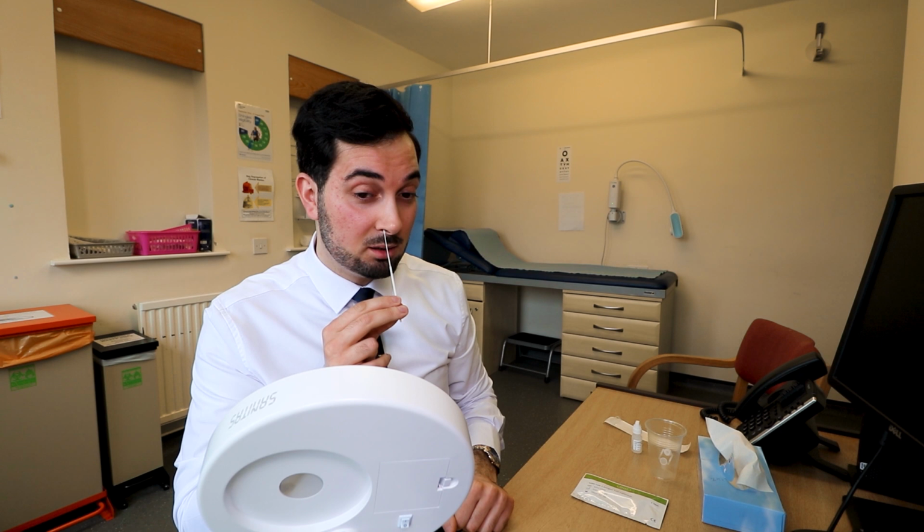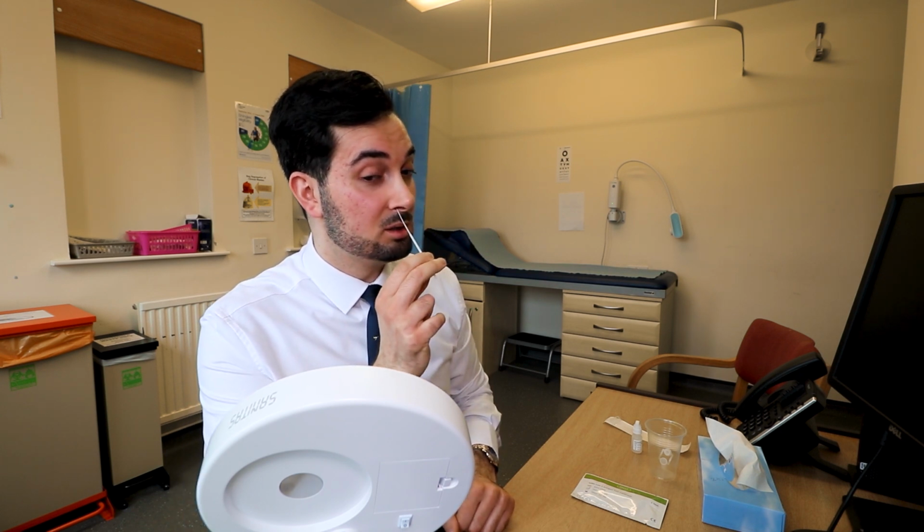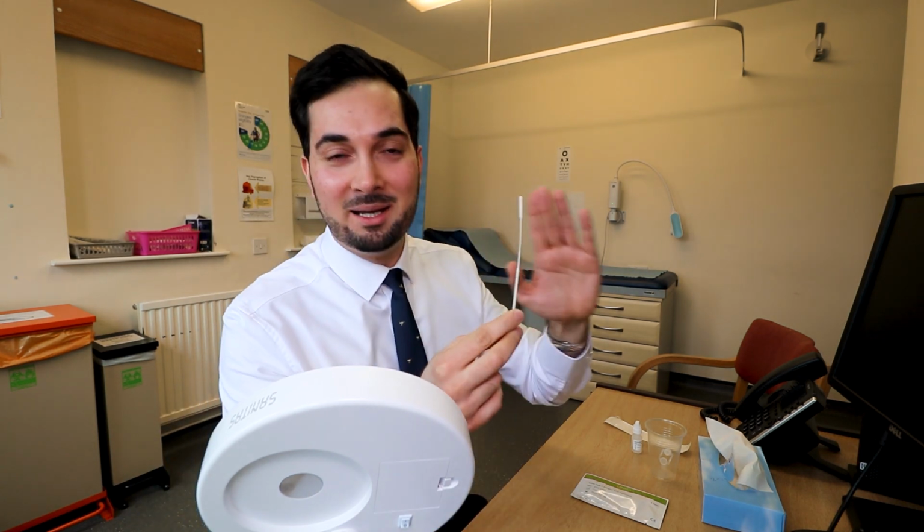So we'll start with the right. So I'm looking at my mirror, and as you can see, I'm going up just to where I'm comfortable, and I'm going to spin. So you can see, I'm spinning it there. I might actually sneeze in a second as well. So that's the first one, and now I'm going to do the second one. So as you can see, rotating it, you want to do it 10 times. I don't even know how many times I've just done it now because I was trying not to sneeze for you on camera, but it's as simple as that. That has now got everything that I need on it, and we're going to move on to the testing solution.